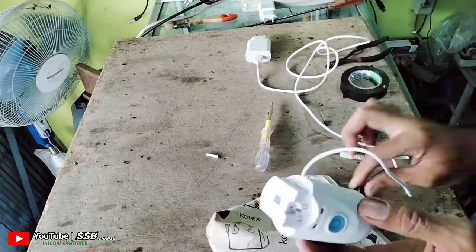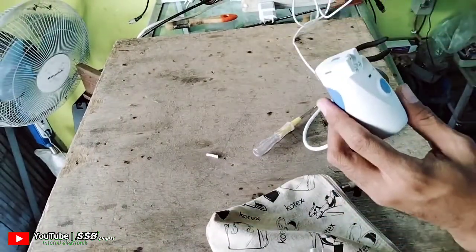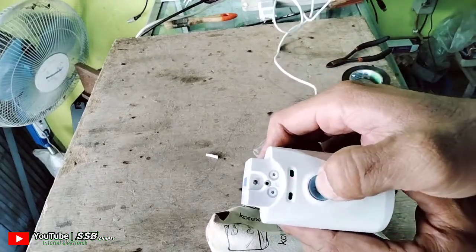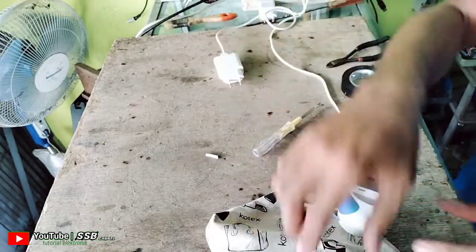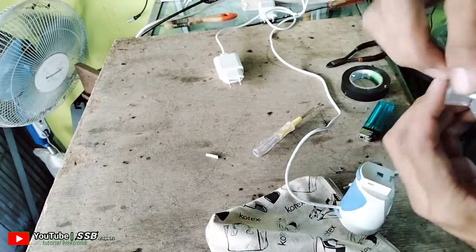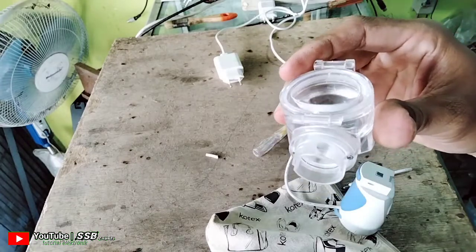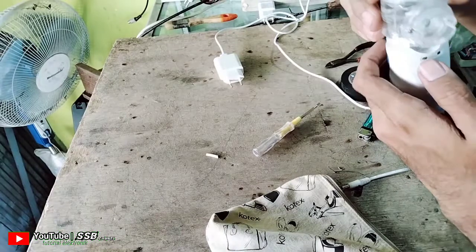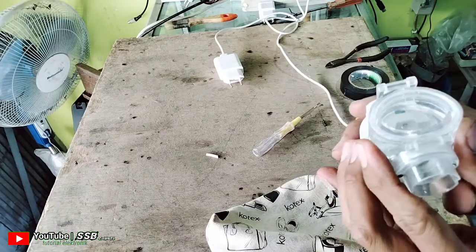Kita tutup lagi. Kita akan mencoba alat ini. Sudah menyala ya. Nanti kita akan mencoba dengan menggunakan air. Ini tempatnya untuk airnya. Kita beri air sedikit saja untuk mencoba. Langsung videonya ya. Kita coba.